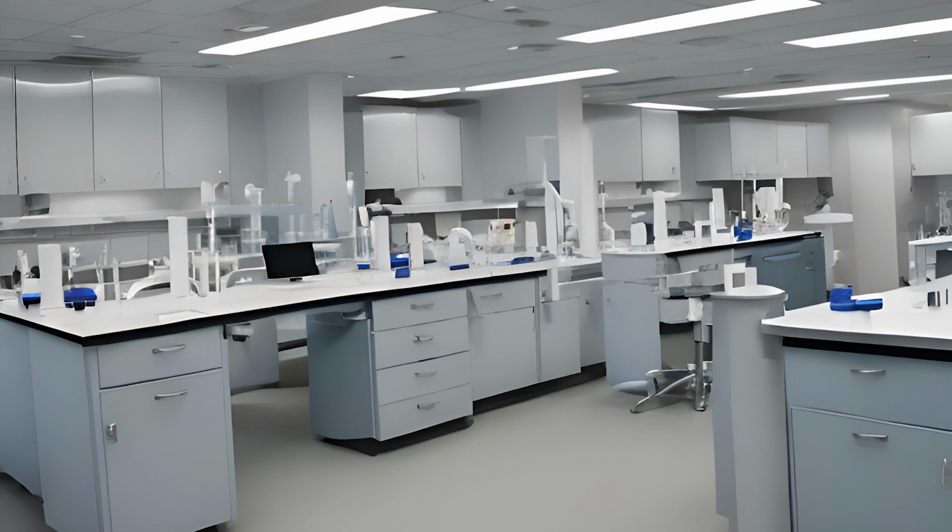When you're getting ready to insert the needle, you want the beveled edge up. That means if I look at the pointy tip of the needle, the beveled edge is the side the opening of that needle is facing towards. I should be able to hold the needle up, look at it, and the open side of the inside of that needle lumen should face me. Position your needle so it's lined up above the vein and following the path of the vein.